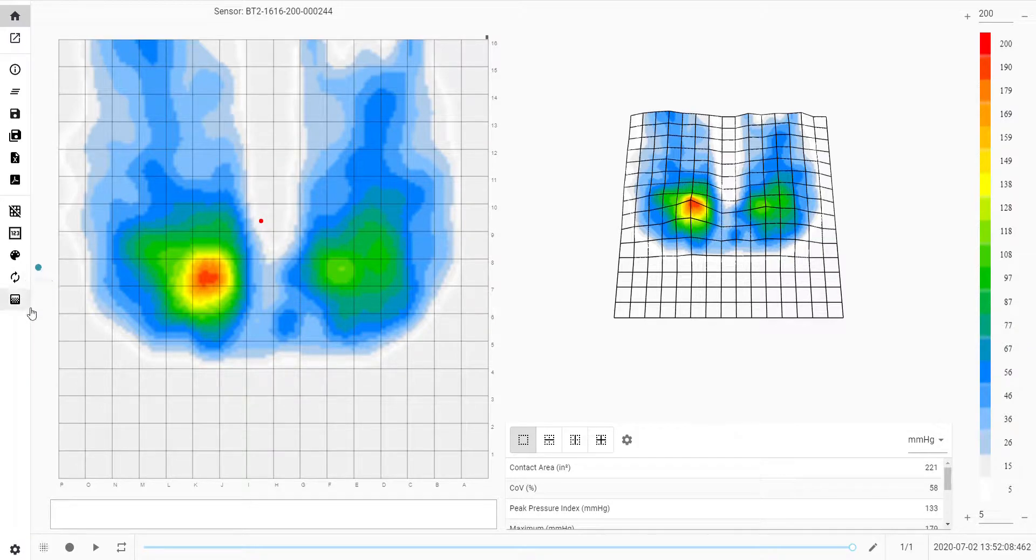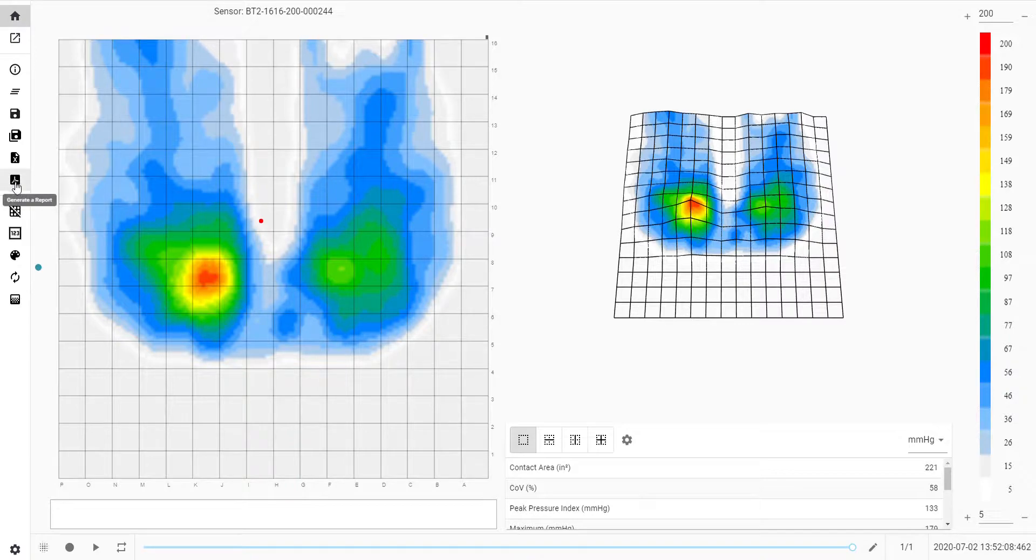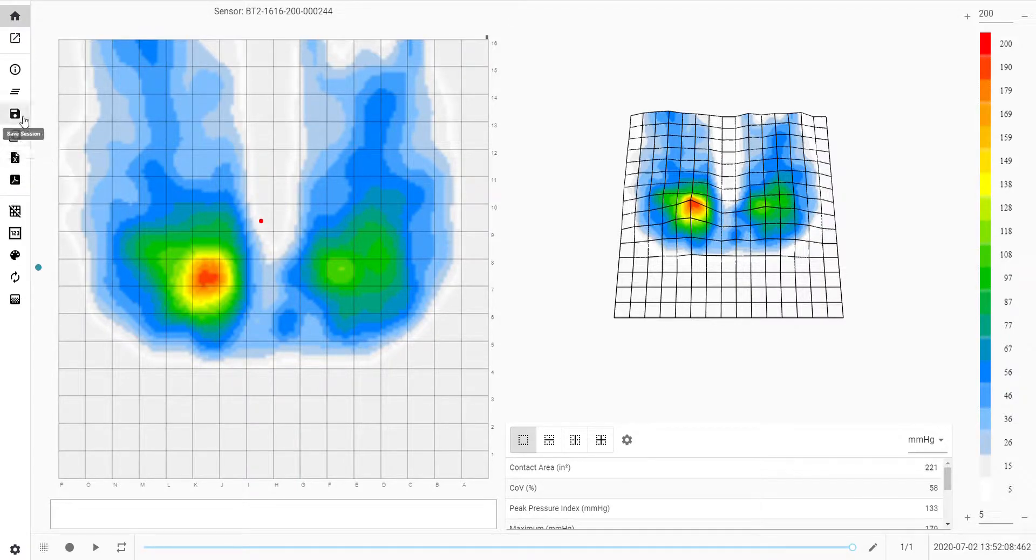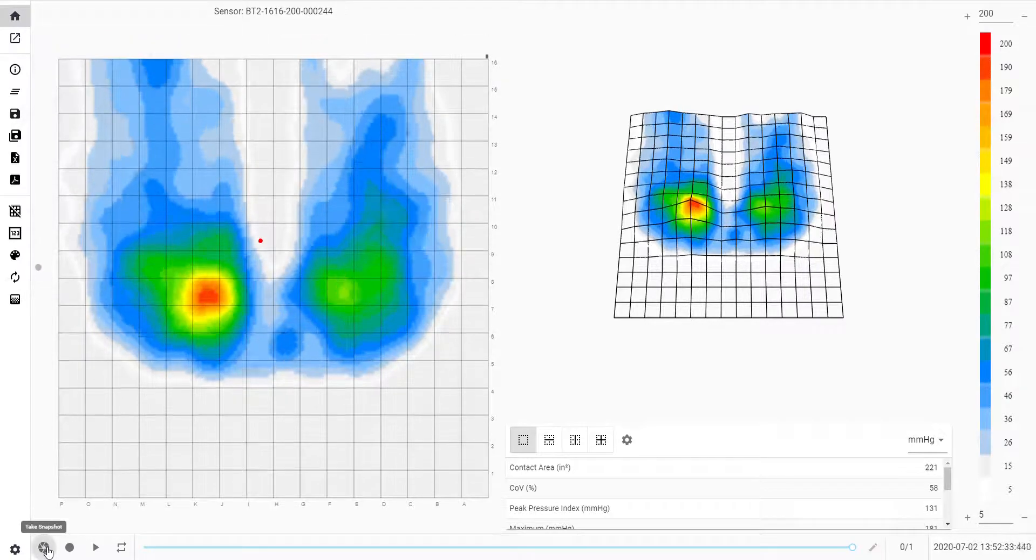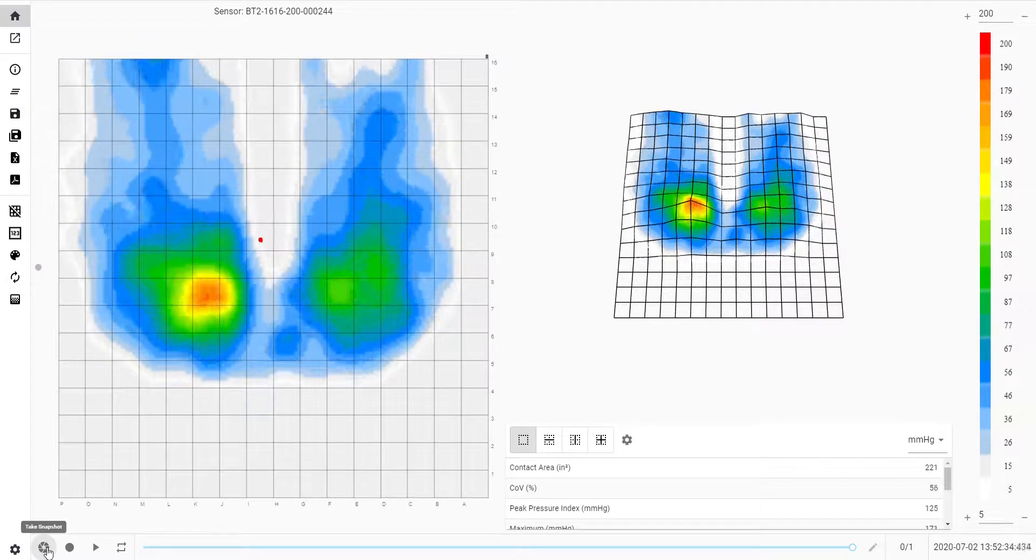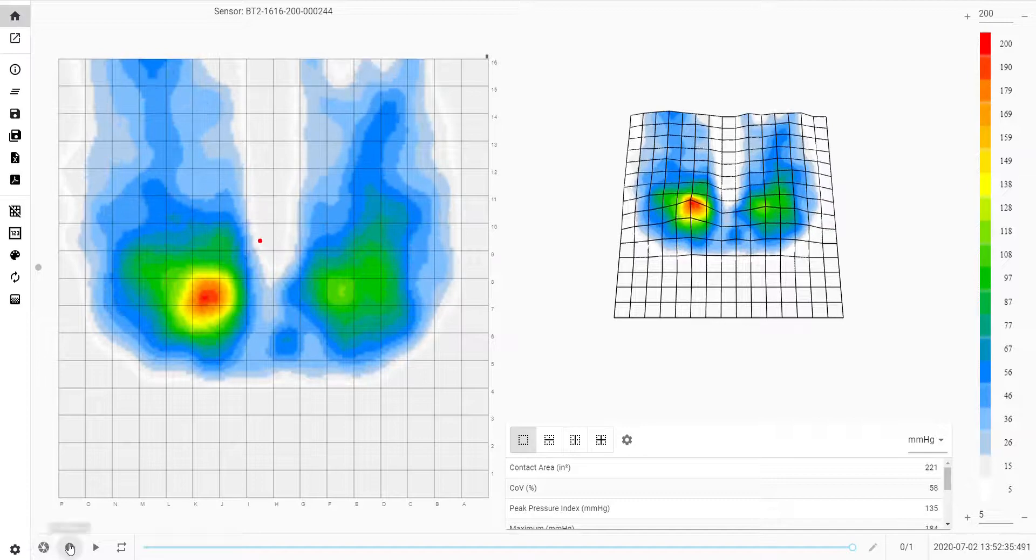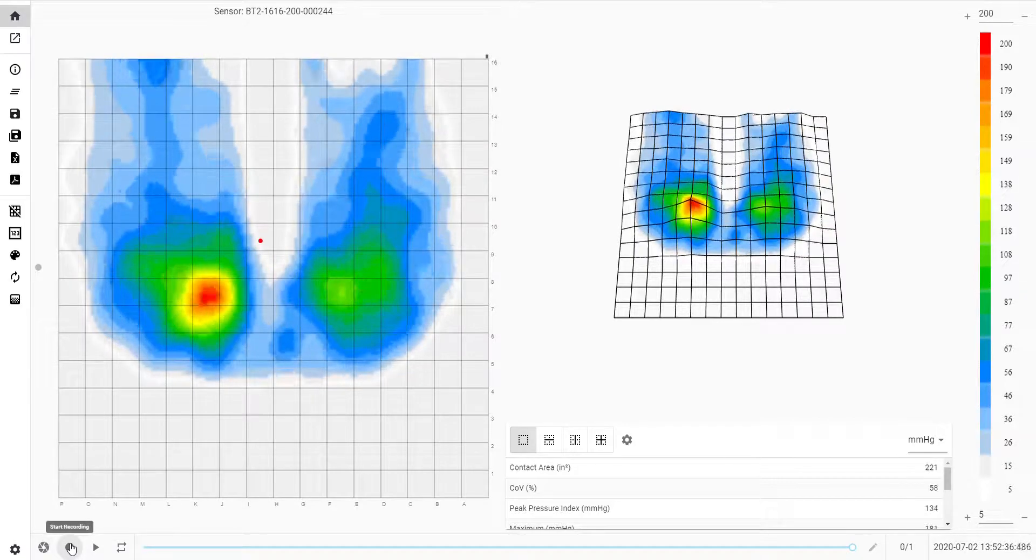As you can see, the previously greyed out icons are now selectable. Here you can save snapshots as PDFs or Excel files. If you click on the snapshot button again, the software will go back to live scanning.